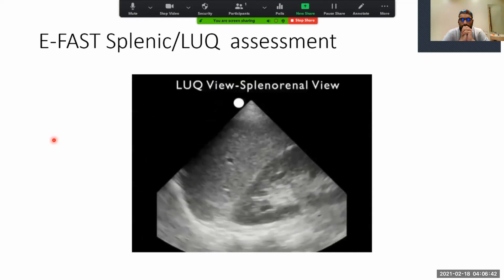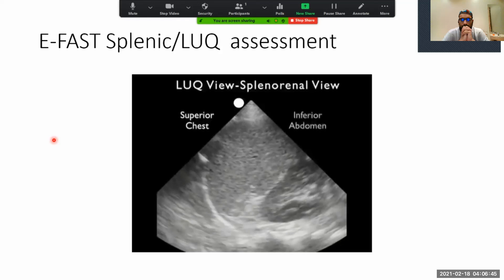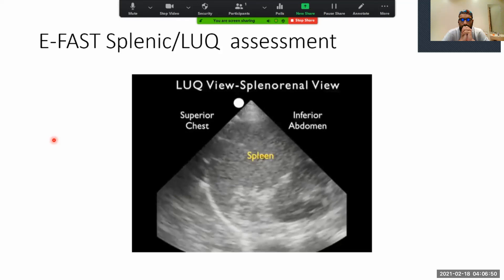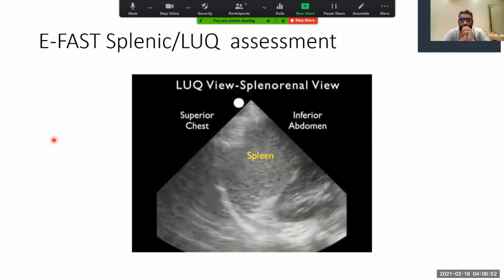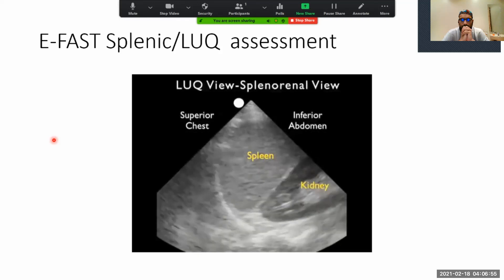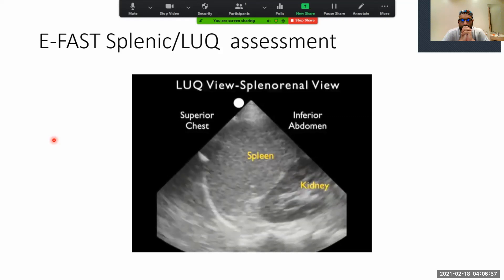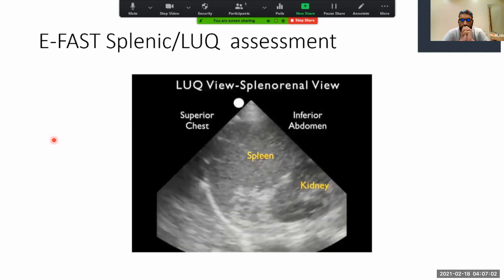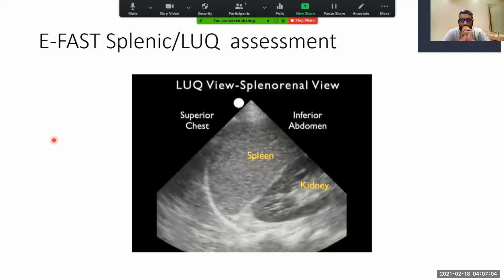Now that we know how to perform the left upper quadrant view, let's look at a normal ultrasound image. The probe is oriented towards the patient's head, so the superior chest cavity is towards the left and the inferior abdominal cavity towards the right. Notice the spleen — the large organ in the middle — and the kidney, the football-shaped organ seen inferior and posterior to the spleen. Notice the curving white line just above the spleen, which is the diaphragm. In the left upper quadrant, fluid will accumulate preferentially between the spleen and the diaphragm as a dark or anechoic stripe.